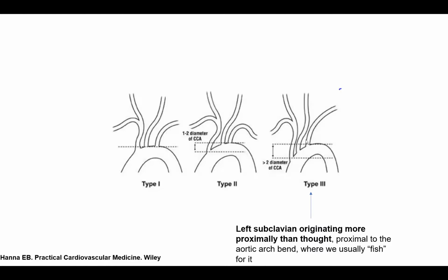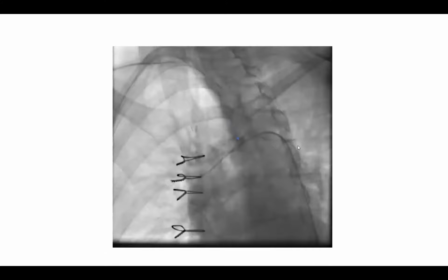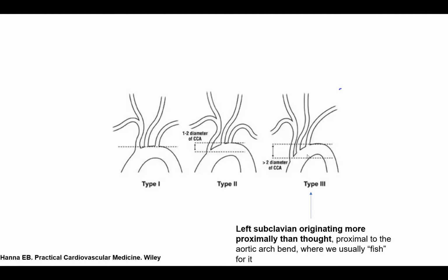This is where my subclavian and supra-aortic vessels are. So you try to put your catheter here and you pull with a counterclock on that ascending portion, not on the horizontal portion of the aortic arch. That should be your immediate reflex. I struggled a lot with this when I was a fellow and even early in my career. Nobody had ever given me this tip until I realized it. It's a fairly simple tip.